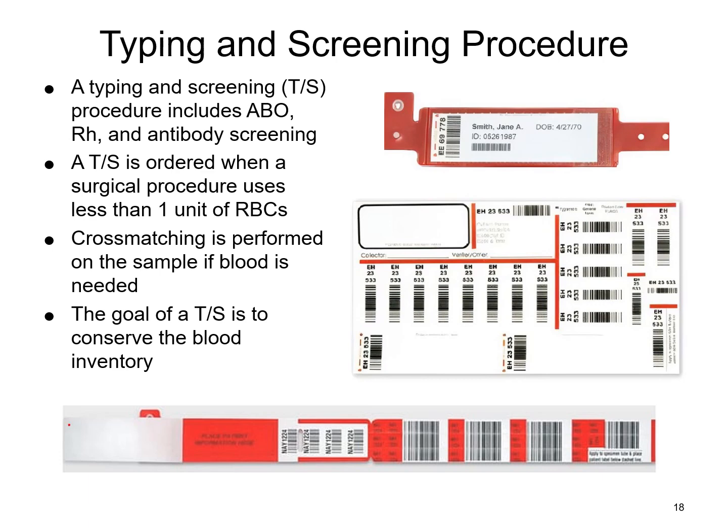So your patient information would go up here, like your name, MR number, and your date and time that you're collecting it, whatever that is, as well as your initials as the phlebotomist. They're going to go over on that bracelet, and typically there's some sort of sticker that will peel up, and then that will go on the tube that has this unique identifier as well.